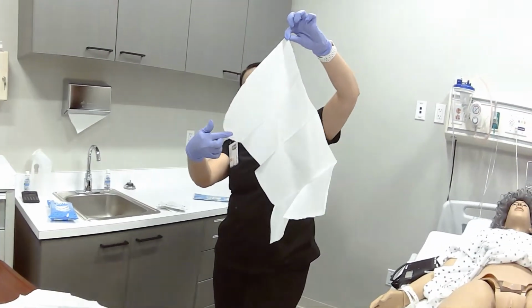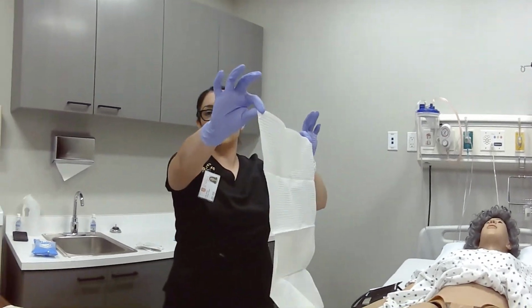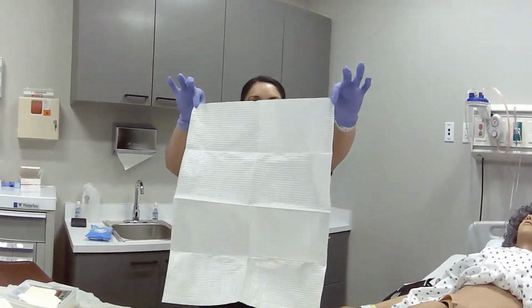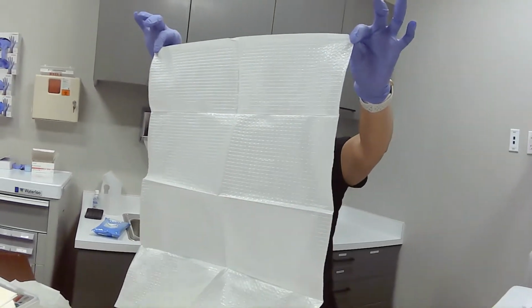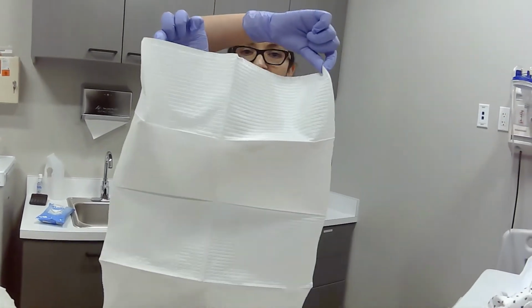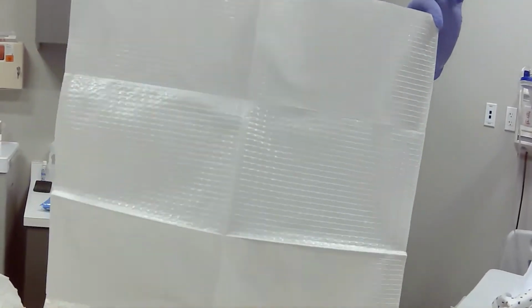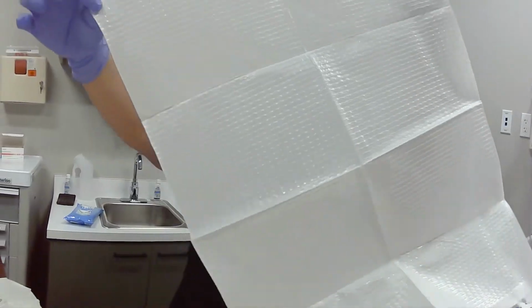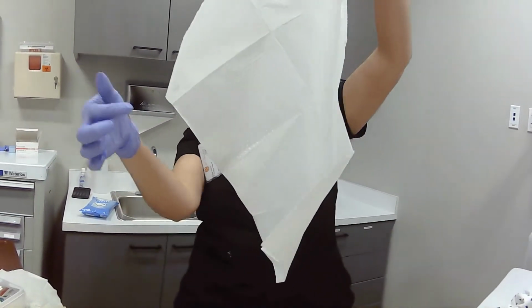Notice how I am grabbing my sterile drape strictly by the 1-inch margin, just by the corner, okay? You're going to see a shiny side and the non-shiny side. If you need to tug at the bottom to straighten it out, you can do that.